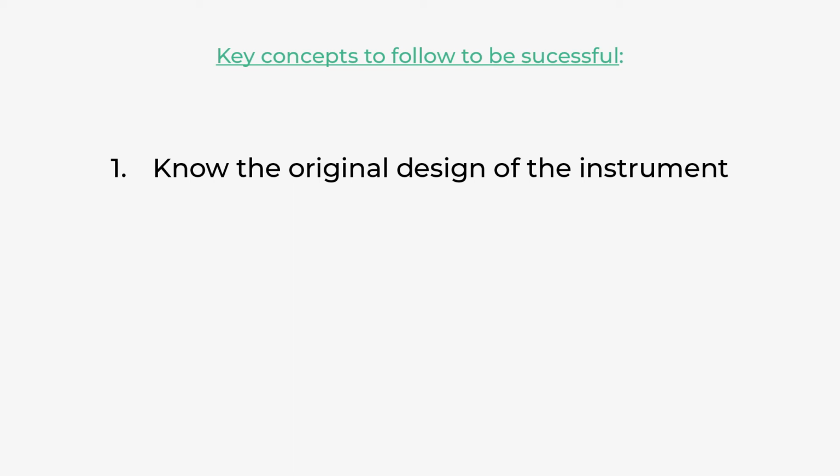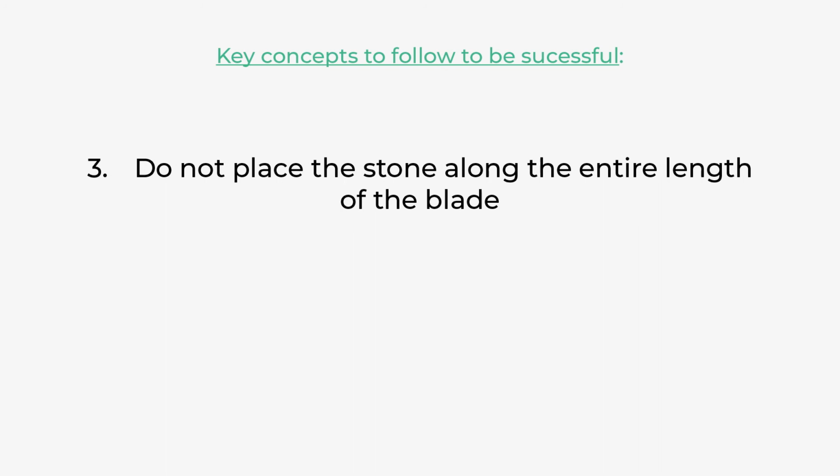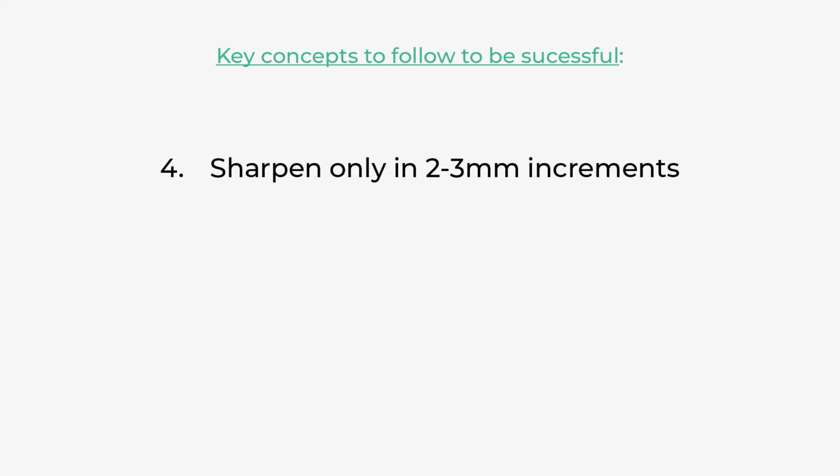1. Know the original design of the instrument. 2. During the sharpening process, keep the face parallel to the floor at all times. 3. Do not place the stone along the entire length of the blade. 4. Sharpen only in 2 to 3 millimeter increments.